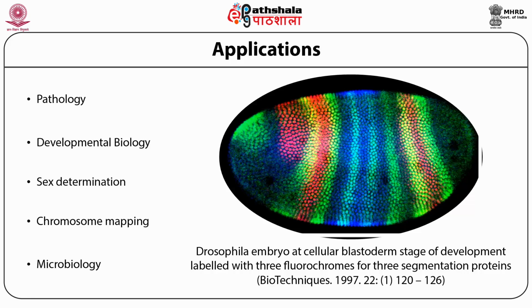Typing of infective agents' genome in the cells and tissues being studied can be indicative of clinical diagnosis and outbreak investigations of an epidemic. The actual cells harboring the infection can be localized by ISH, as in the case of HBV infection in hepatocytes. Thus, the mode of transmission of viruses from cell to cell can be studied.